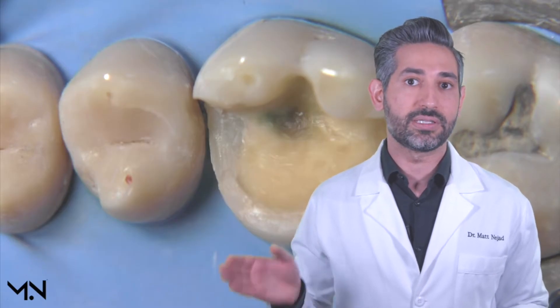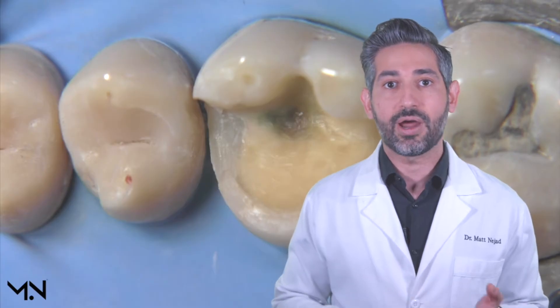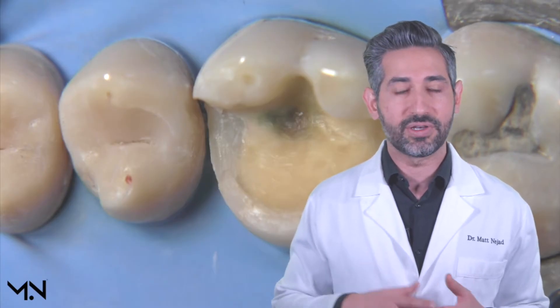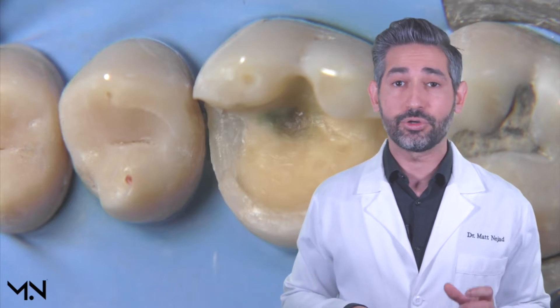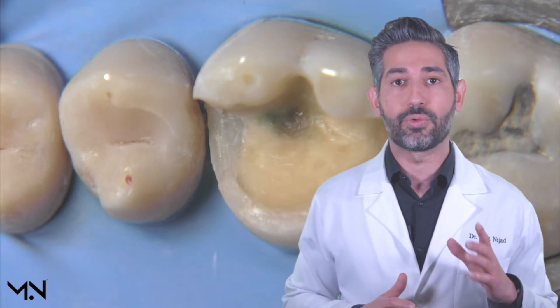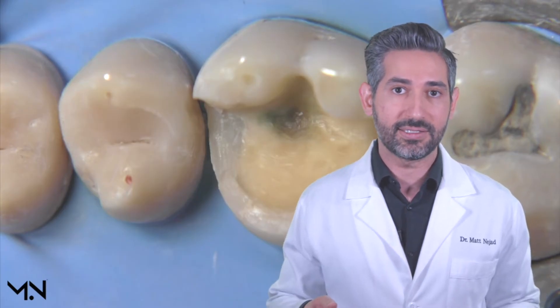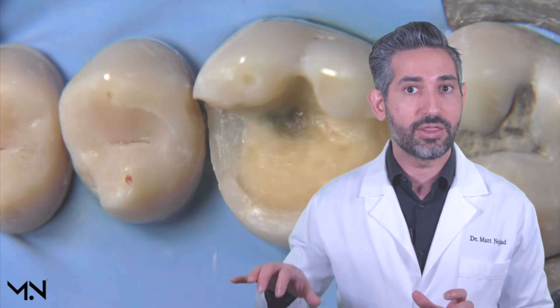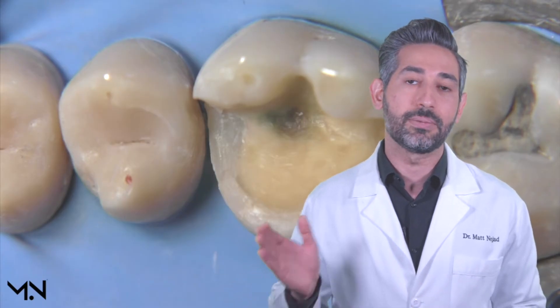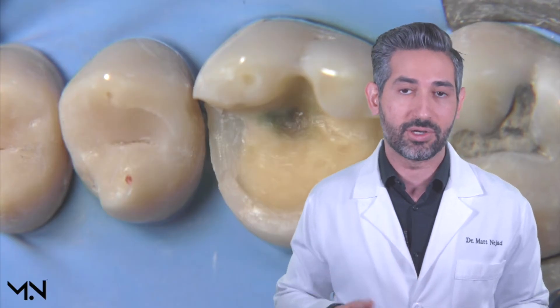There are a lot of advantages to doing this immediately for all our indirect restorations, including crowns, inlays, onlays, veneers, and basically any lab-made restoration. For every direct restoration we do, you're always doing immediate dentin sealing, but when you do indirect restorations there's a big change, and doing it immediately has a lot of advantages, so we want to do that for our indirect restorations as well.